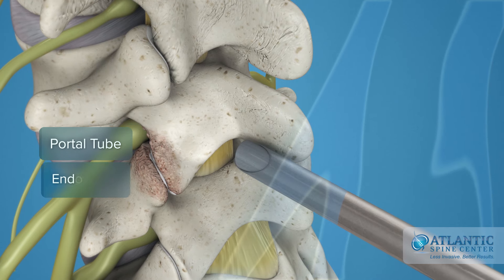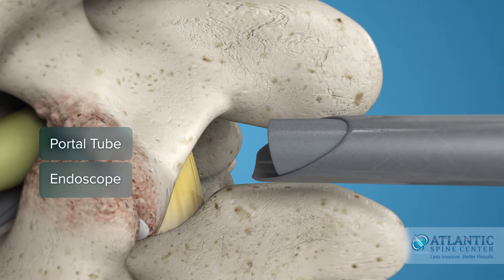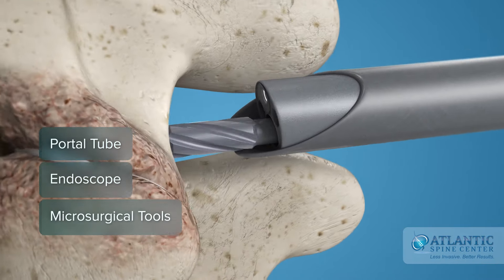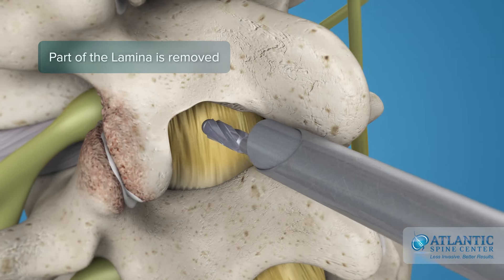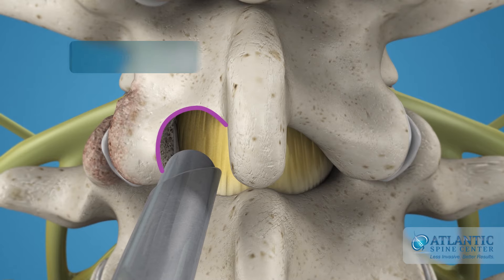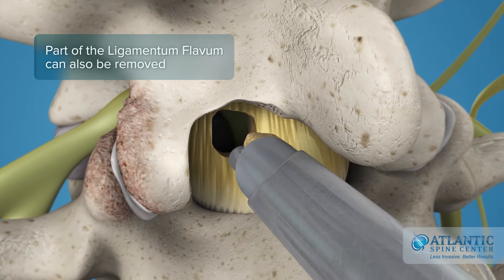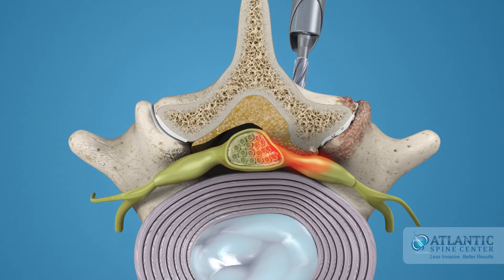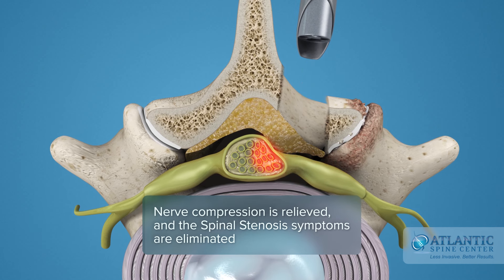The endoscope is placed through the tube and the lower end of the laminae are identified. With this close-up operative view, your surgeon can then microsurgically remove the small area of the lamina bone. This process is called a laminotomy. Then the part of abnormal thickened ligamentum flavum can also be removed. All this frees space for the nerve and spinal cord and relieves compression, thereby eliminating the symptoms of stenosis.